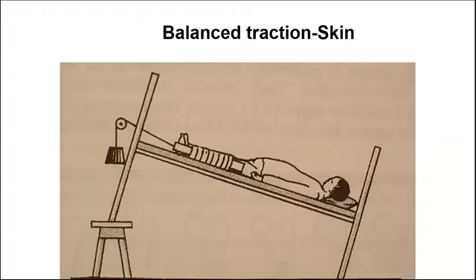Because this is balanced, the reason for balance is that the traction is provided by the weight and counter traction by the body weight. And this is achieved by elevating the foot off the bed using a 6-inch block, or basically a stool.